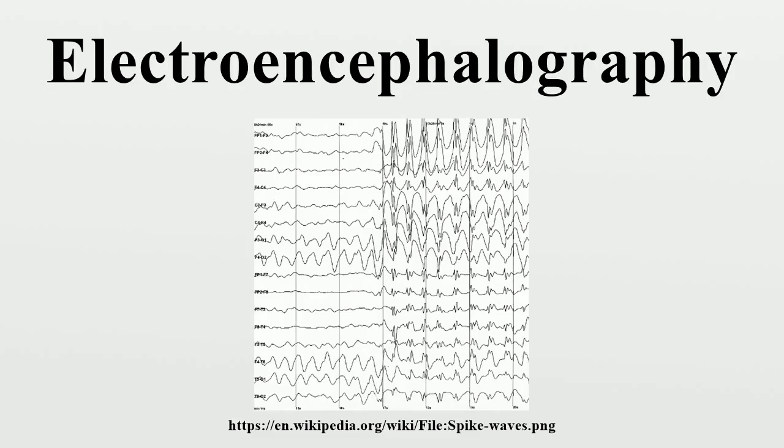If a patient with epilepsy is being considered for resective surgery, it is often necessary to localize the focus of the epileptic brain activity with a resolution greater than what is provided by scalp EEG. This is because the cerebrospinal fluid, skull and scalp smear the electrical potentials recorded by scalp EEG. In these cases, neurosurgeons typically implant strips and grids of electrodes under the dura mater, through either a craniotomy or a burr hole.